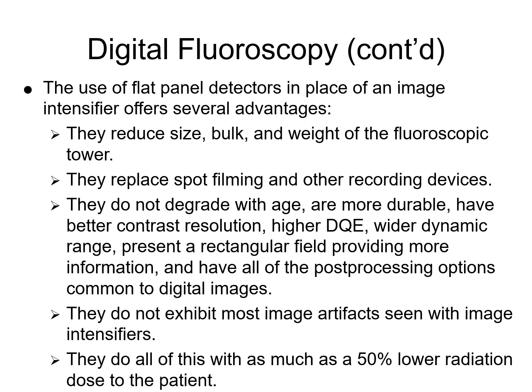Okay. Wider dynamic range. Dynamic range is the ability of the system to display shades of gray. Typically your digital software systems have dynamic ranges in the tens of thousands. It's not unheard of for the software to be capable of displaying 30,000 different shades of gray. Now it doesn't actually display the entire dynamic range. It displays the grayscale, which is a section of the dynamic range. And typically the grayscale is somewhere around the limits of human vision, which, I told you before, is 15 different shades of gray. That's all the contrast range we can stand.